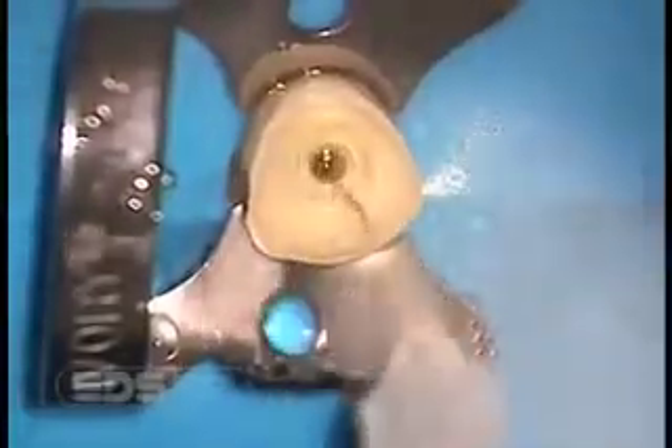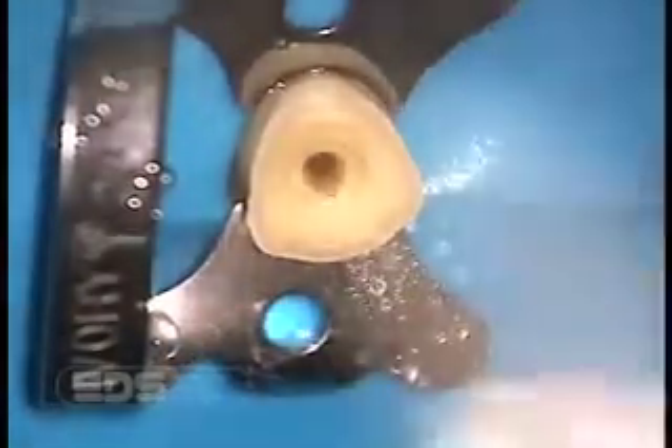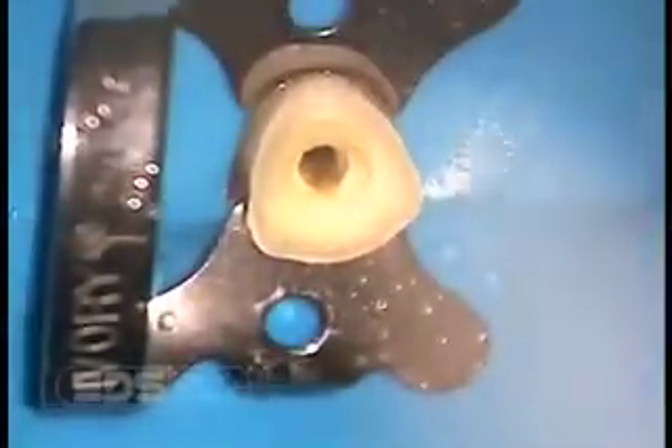The post must always fully seat. You can determine full seating of the post by the flush fit of the flange with the coronal dentin. The flange must always be fully seated within its preparation. If not, you reduce the post's stability and retention, and you increase the chance of post fracture under function.